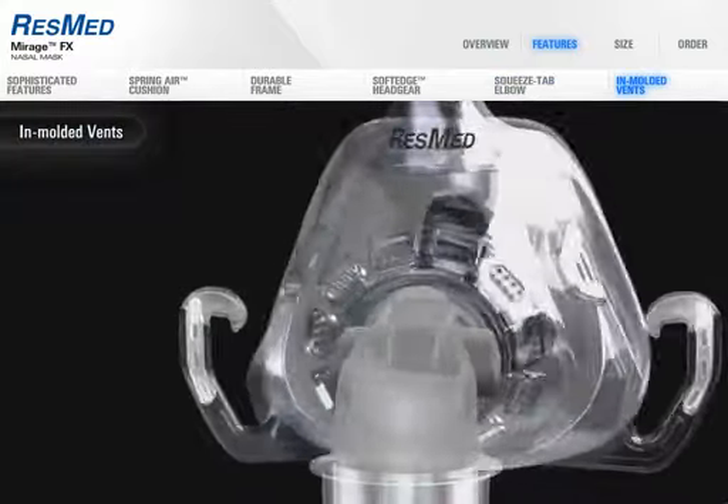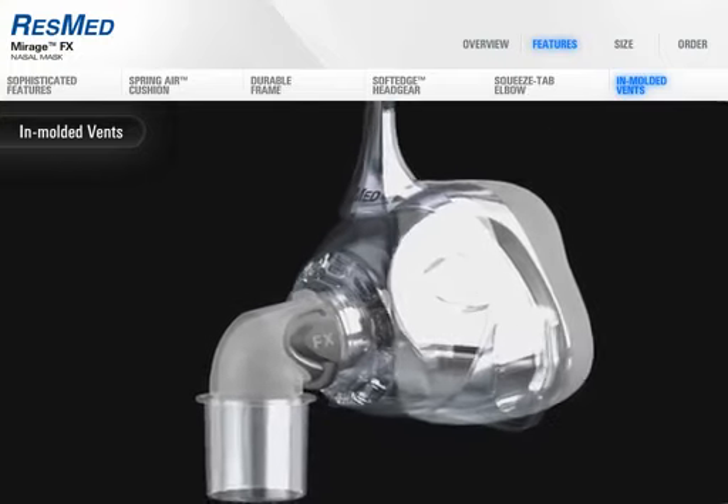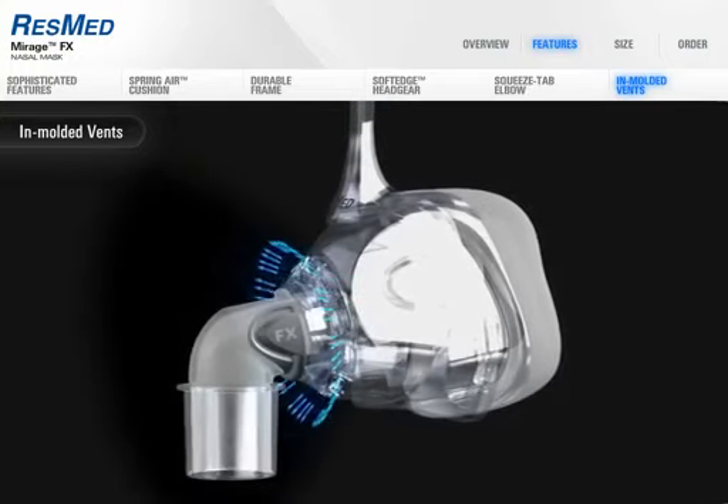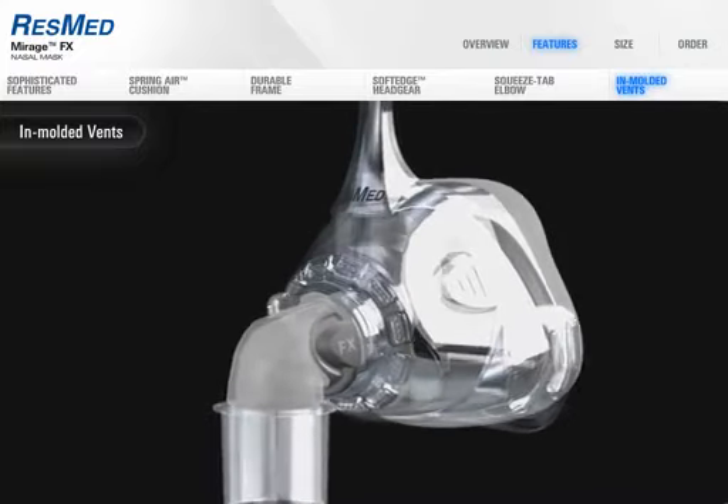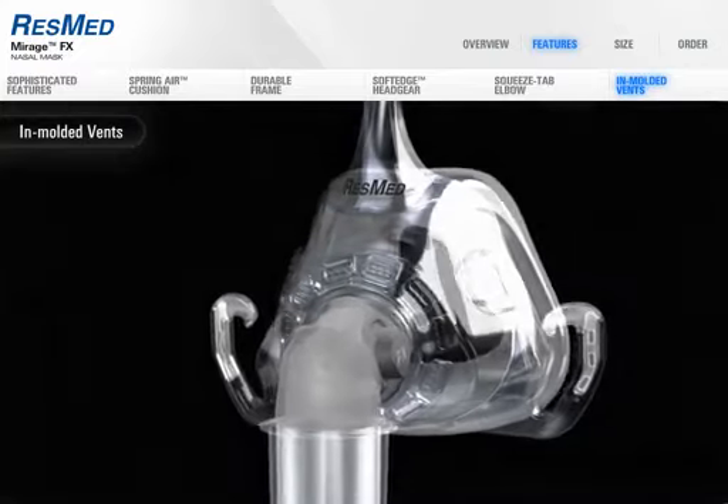The diffuse vent design is molded into the cushion to disperse air gently and quietly. Air is directed away from the user and their partner, so both can enjoy a peaceful night's sleep.